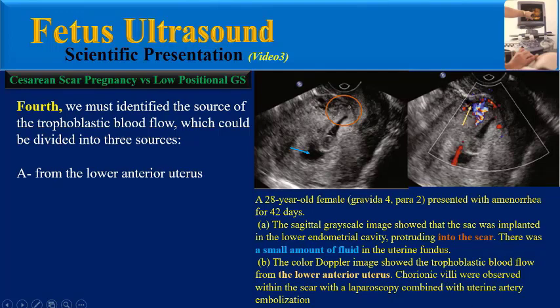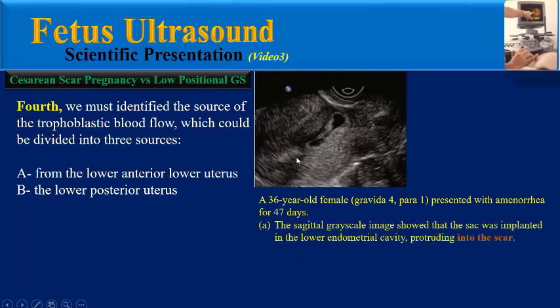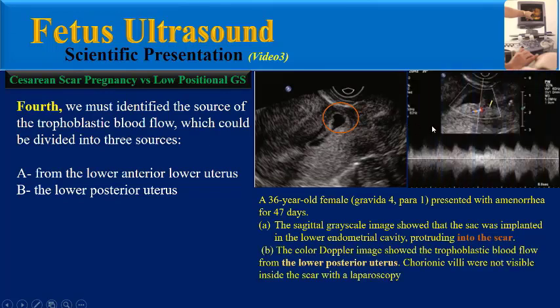Chorionic villi were observed within the scar with laparoscopy combined with uterine artery embolization. Another type is from the lower posterior uterus. In another example, a 36-year-old pregnant female: the sagittal grayscale image shows that the sac was implanted in the lower endometrial cavity, protruding into the scar. The color Doppler image shows the trophoblastic blood flow from the lower posterior uterus, and chorionic villi were not visible inside the scar with laparoscopy.